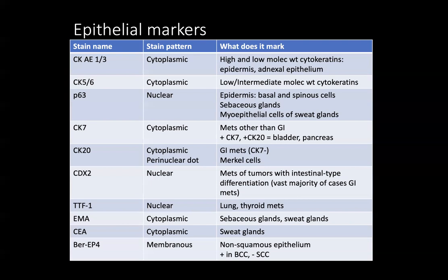And I often do it when I'm looking at tumors on the scalp that look like they're spindle cell, epithelioid cell, and we're trying to make sure it's an atypical fibroxanthoma or a pleomorphic dermal sarcoma versus a spindle cell or sarcomatoid squamous cell carcinoma. So we'll do p63.